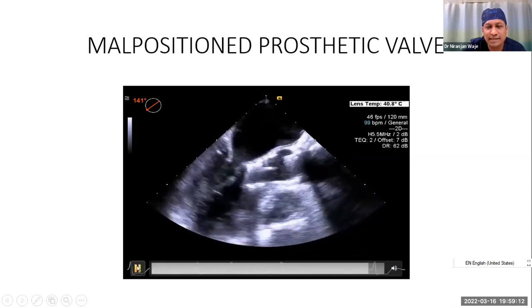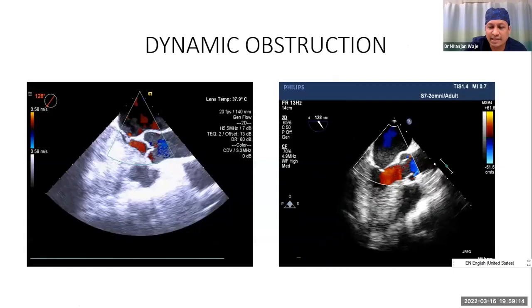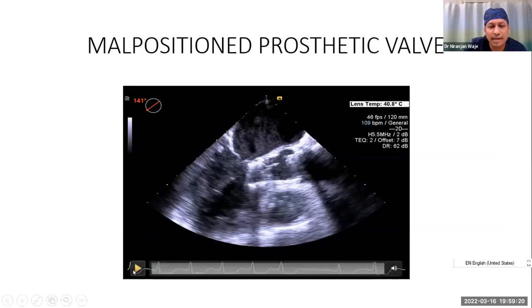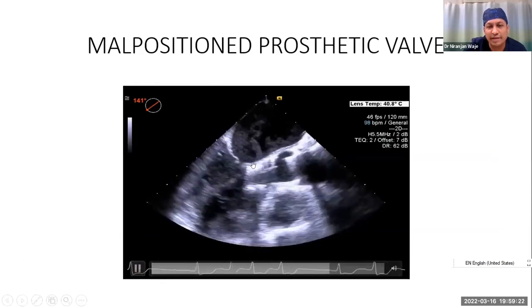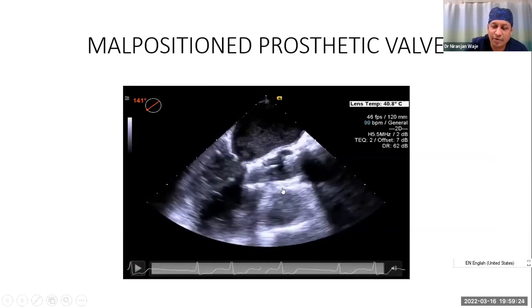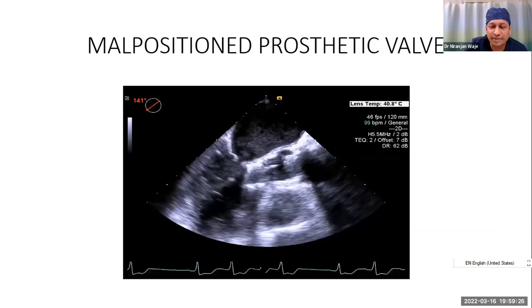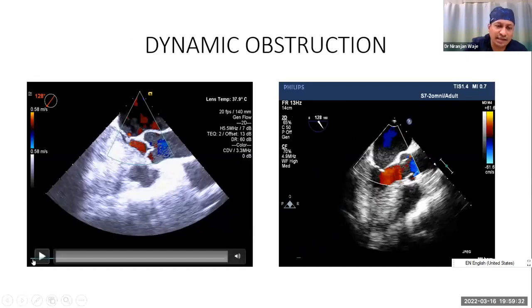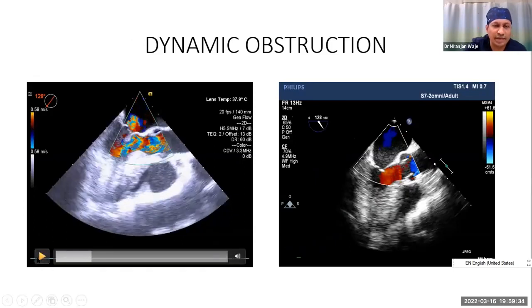It has been accidentally malpositioned too deep into the LVOT, preventing the opening of the mitral valve here. So we had to go back on pump to rectify the position, and things were sorted out. So obstruction can be not only static, it can even be dynamic obstruction.